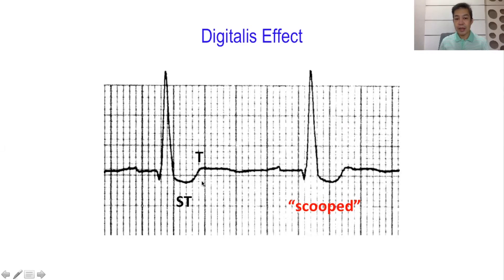For example, in this ECG tracing, the T wave is initially negative, becoming positive but flattened. This characteristic combination of ST segment depression and a diphasic T wave with initial negative deflection produces the scooped appearance, which is quite typical of digoxin effect in the body.